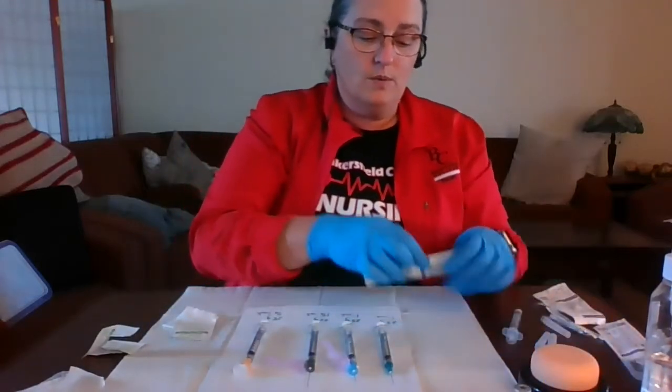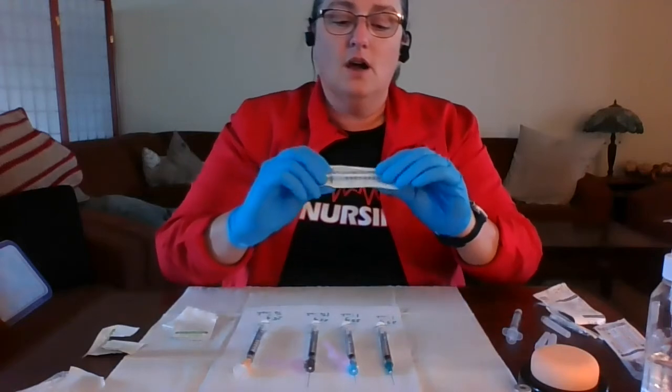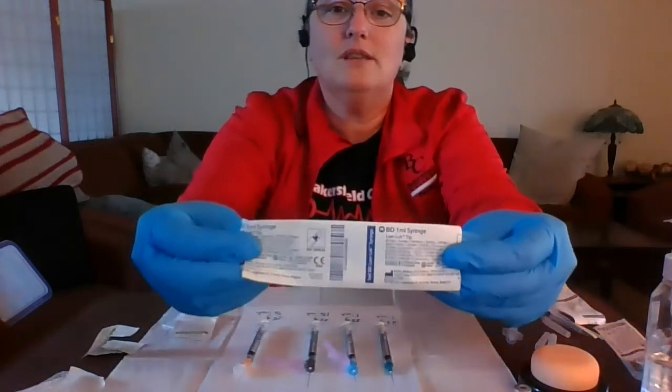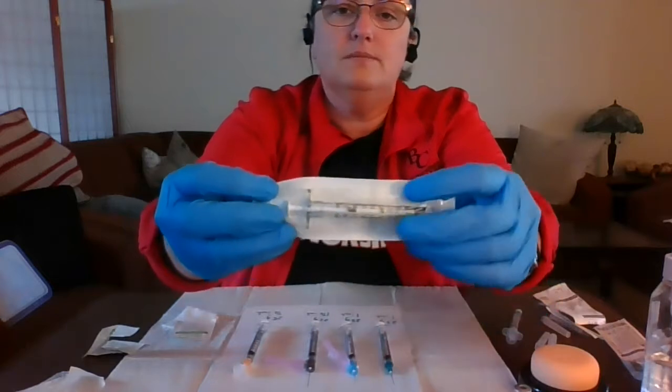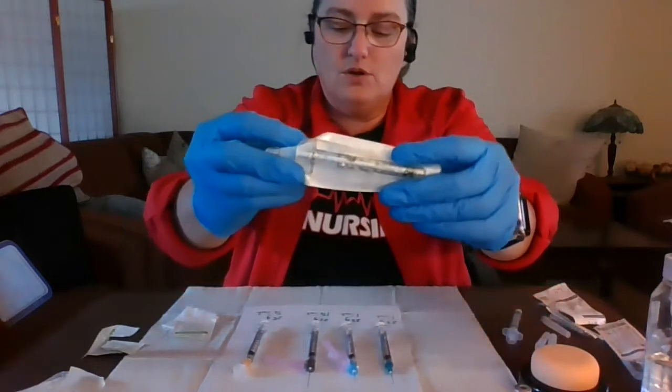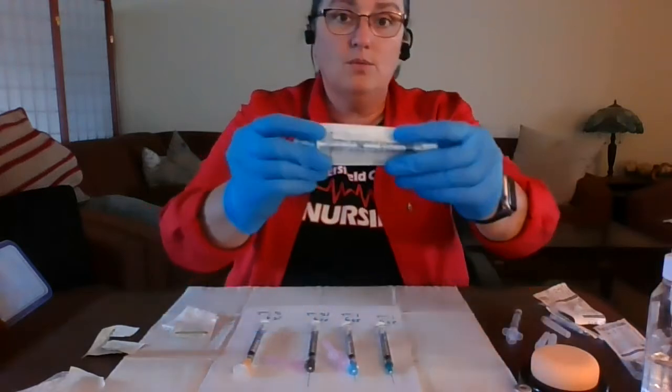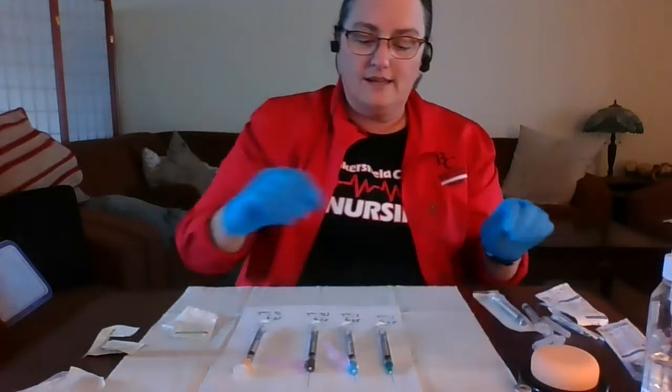The syringes that we are using for our vaccines are typically a 1 ml syringe, and this is what the package looks like, 1 ml, different brands. And I will show you as I hold up my other syringes here the markings on these, and we will go over this in another lesson.